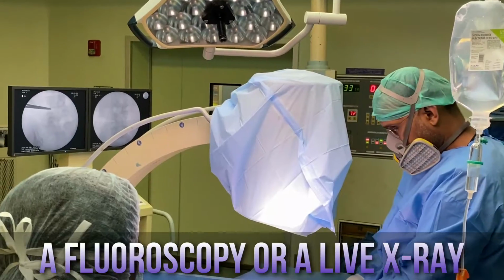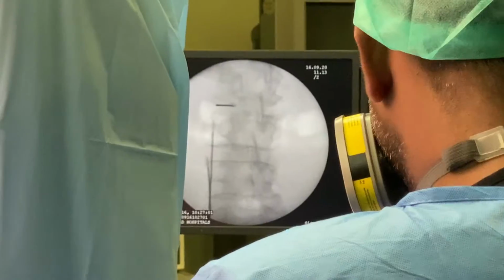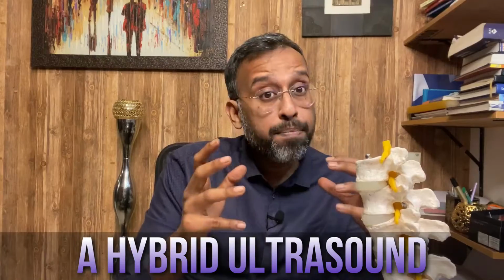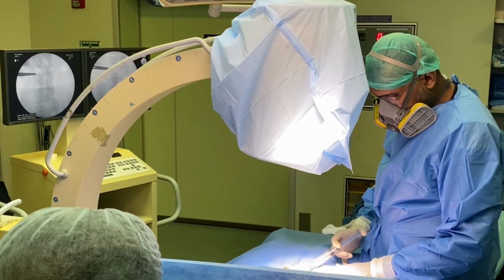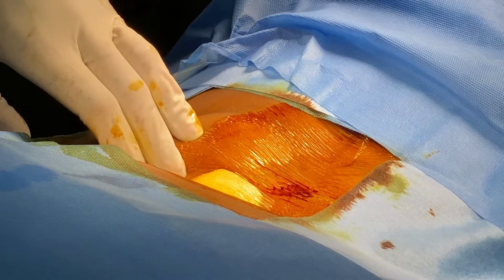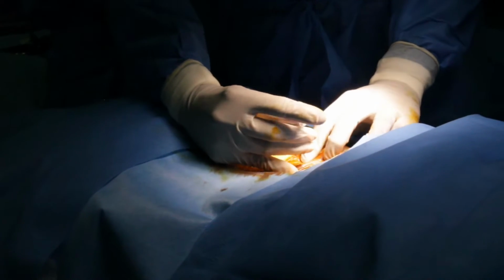That is, we use a fluoroscopy or a live x-ray to locate the position of the disc. So that shows me the bones, and then I also use a hybrid ultrasound and place the probe right on the disc in order to see the soft tissue. And using the ultrasound probe and the fluoroscopy, I can enter into a space known as the transforaminal space. It is a small triangular space called the Cambin's triangle. And once I enter that space, I have access into the disc.